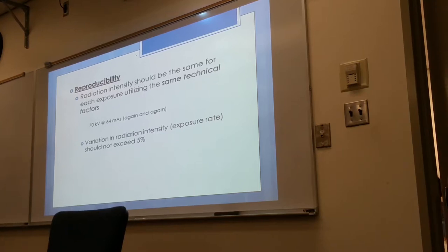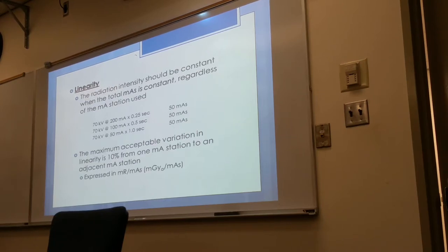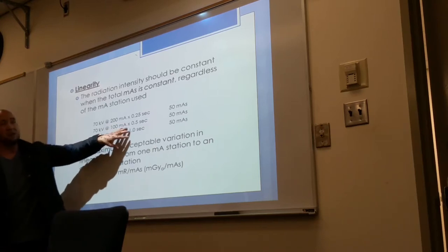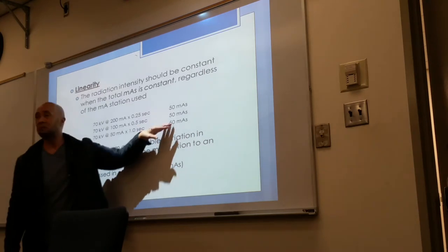Any questions on reproducibility? Okay, on that, I did the QA at the hospital, because they were looking for the same thing. It's like the index number has to be the same in all the exposures. That's what you're talking about, right? It could be. But there's something similar to that too. So we have reproducibility, but there's also linearity. Linearity is similar to this, in that with linearity, the radiation intensity should be constant, even if you're using different combinations of mA and time, as long as the total mAs is the same.